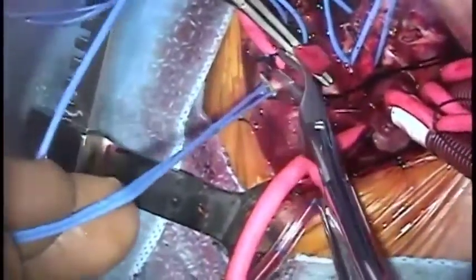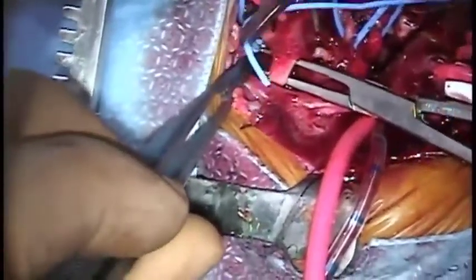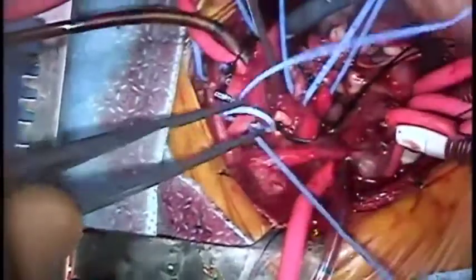Next, attention is turned to the aortic arch. The circulation is arrested and the aortic arch branches are occluded with silastic slings. Clipping and cutting them ensures that the shape of the arch is not distorted. The arterial cannula is advanced into the left carotid artery and snared in place for later use during anterograde head perfusion.